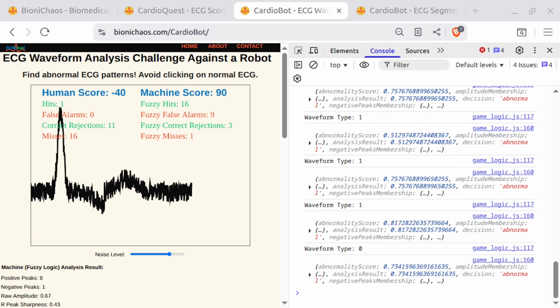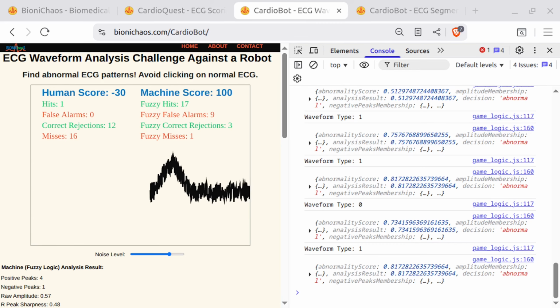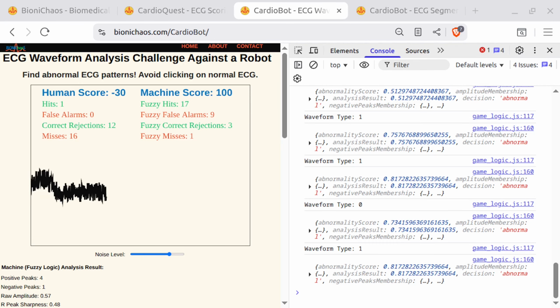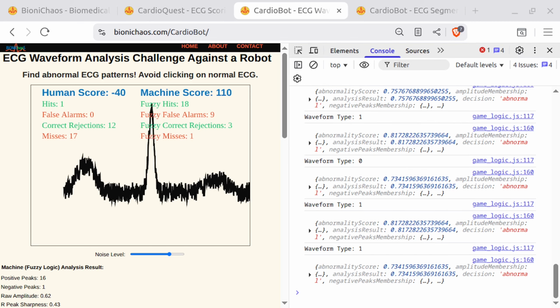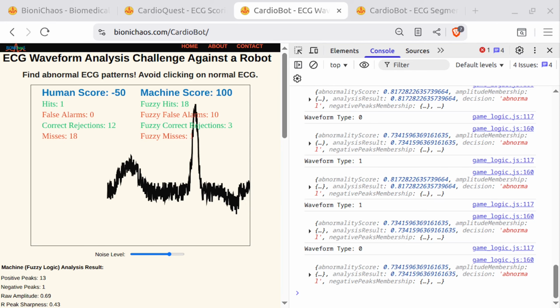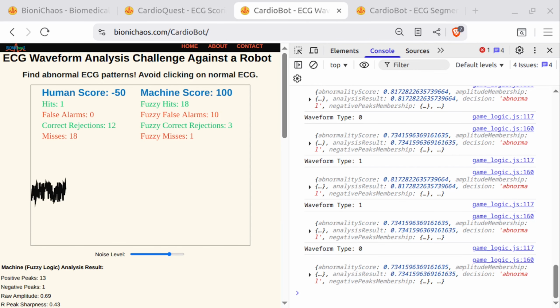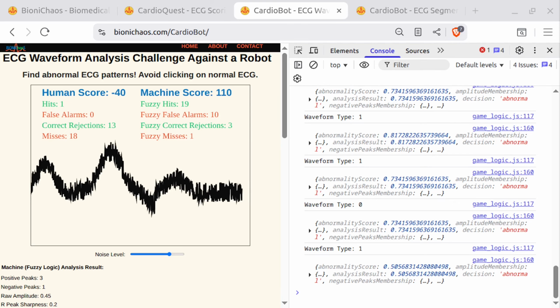You see, that's where we differ. I would have just told the user, hey, for the best experience, just tilt your head and squint. Or buy a smaller monitor. We're not made of magic here. But you build a whole new house next to the first one just in case someone with a wider car drops by. It's about anticipating user needs, like adding the spacebar shortcut for next rhythm. It reduces friction.